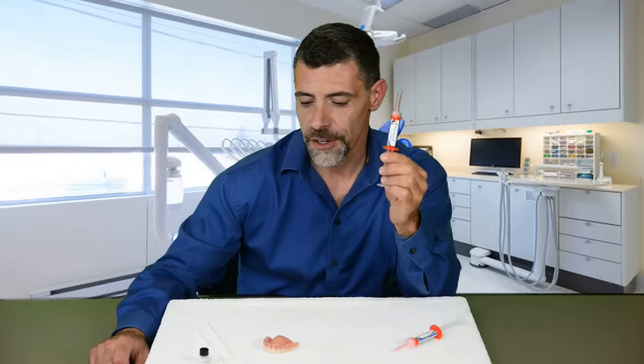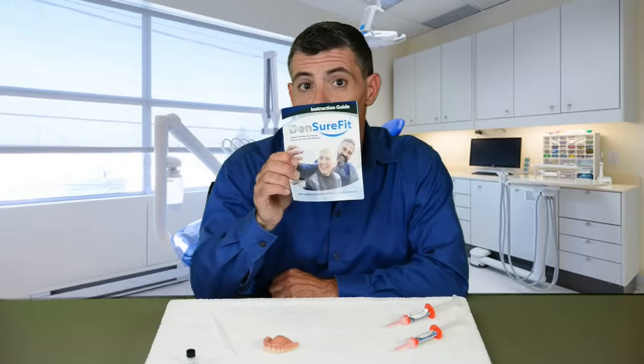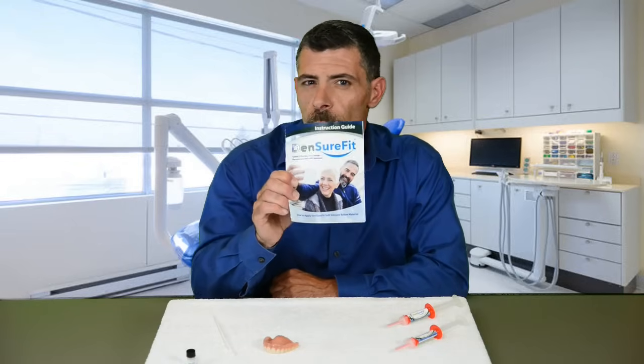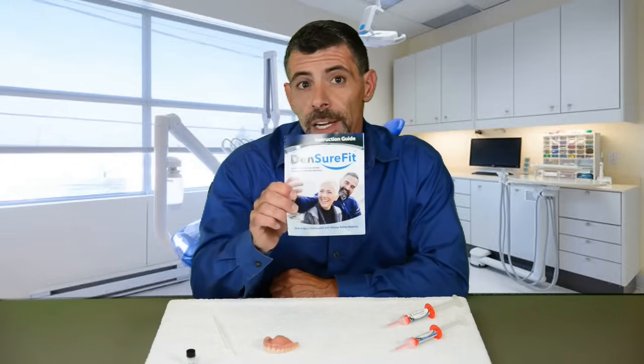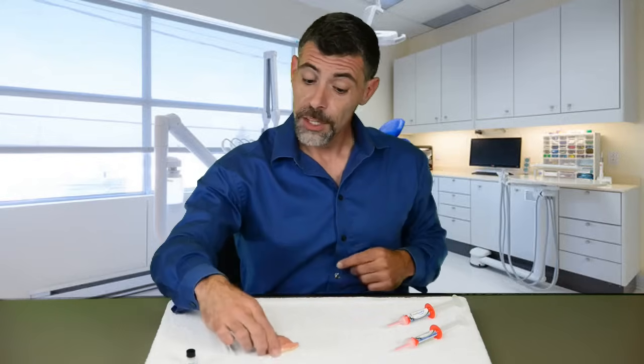So what's in the kit? We have two applicators of the DenSureFit soft silicone that will fill the voids in your denture. We have our primer that will allow that silicone to stick to your denture. We have two swabs and our handy dandy instruction guide.